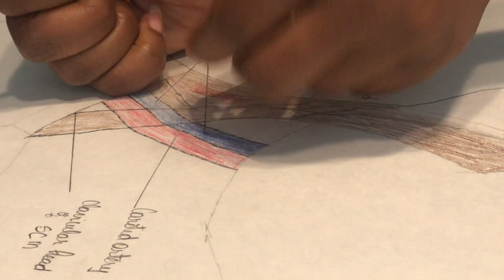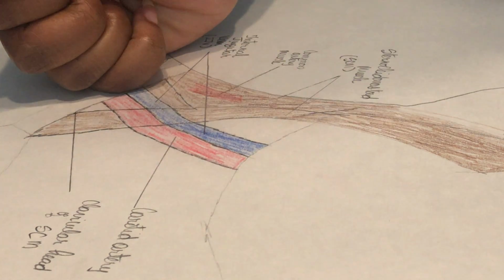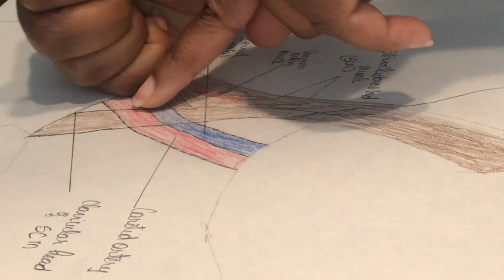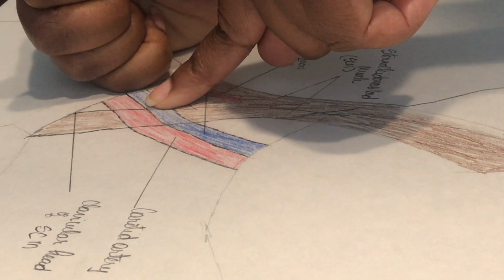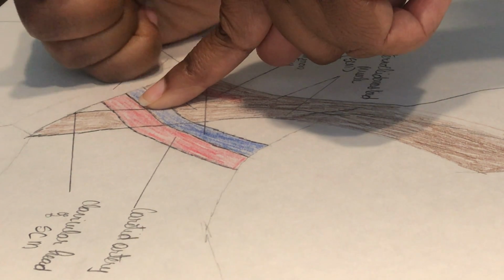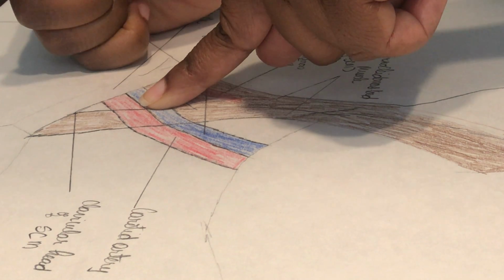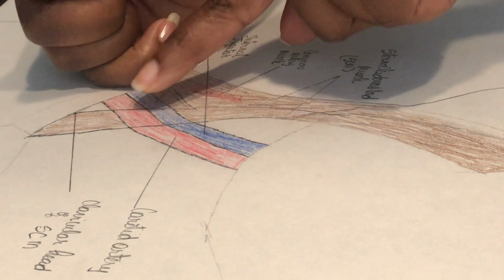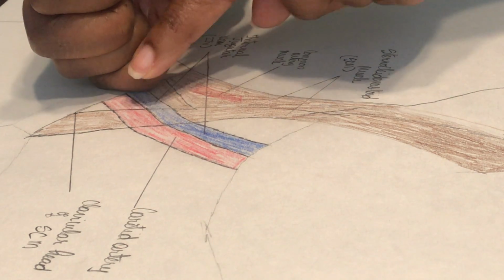Then we get our needle. That's the needle we're going to use to guide our guide wire. We puncture the skin. Make sure that we don't move. While we're puncturing the skin, we can move our ultrasound machine away from the needle, so we can make sure that we can see the tip of the needle in the vessel. Once the needle is in the vessel, we can see blood return into the syringe.